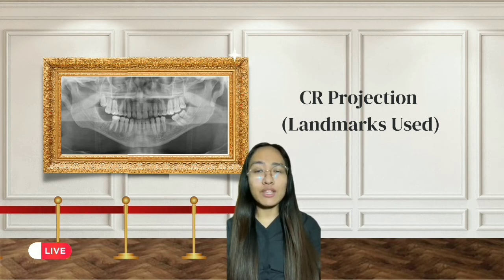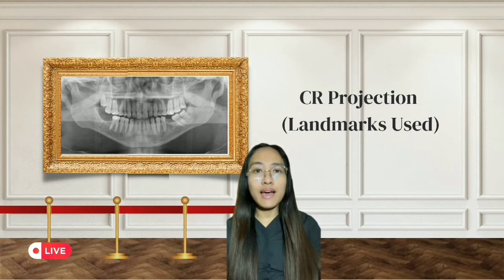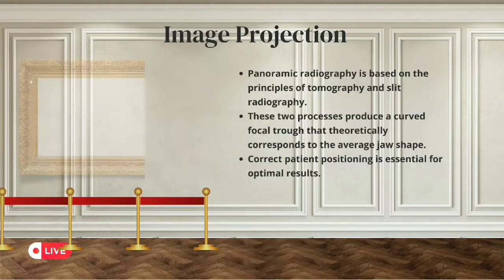Such an image is not always possible. Minor errors may be present that do not affect the diagnostic quality of the image. In such cases, a retake of the panoramic image is unnecessary. A diagnostic panoramic image must demonstrate accurate anatomic features and proper exposure resulting in correct density and contrast.